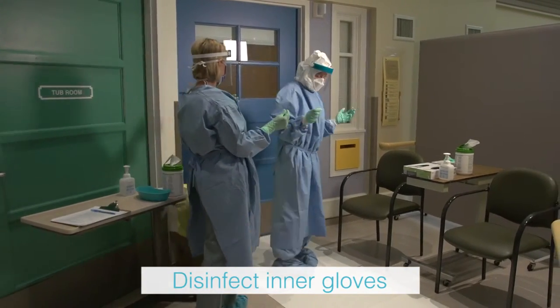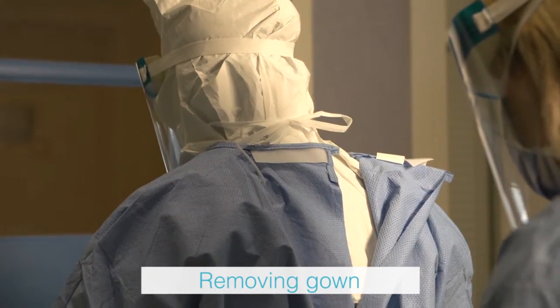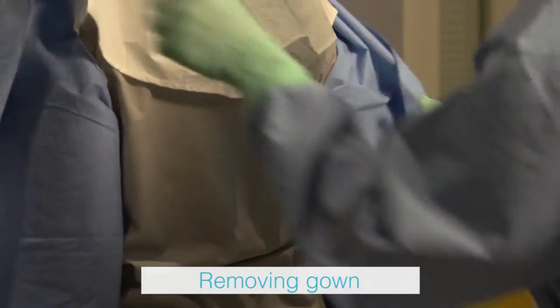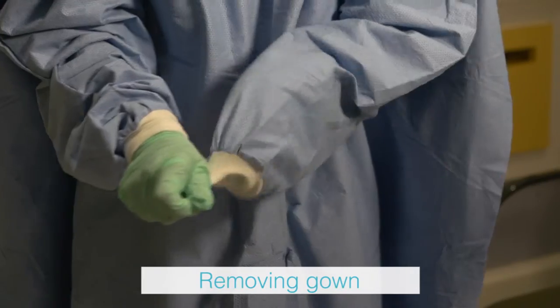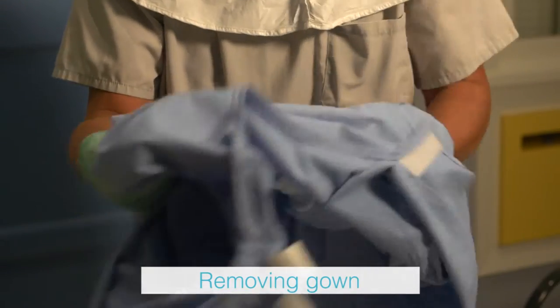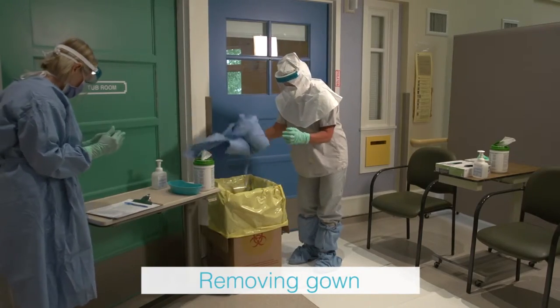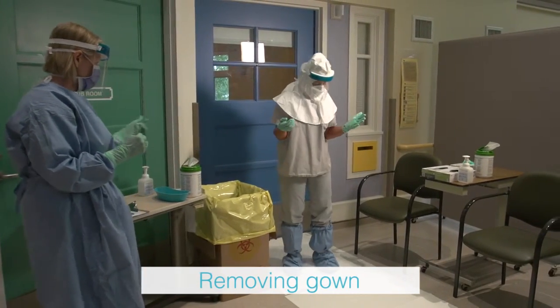The health care provider removes the gown in a manner that prevents contamination. The trained observer carefully unfastens the top velcro followed by the waist tie. The health care provider slides two fingers under the cuff of the gown and pulls the hand into the gown. Using the covered hand, the health care provider grabs the opposite sleeve and pulls it away from the body over the hand. The gown is folded inward onto itself, rolling away from the body until small enough to place in the waste receptacle.